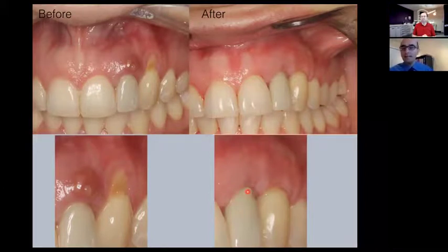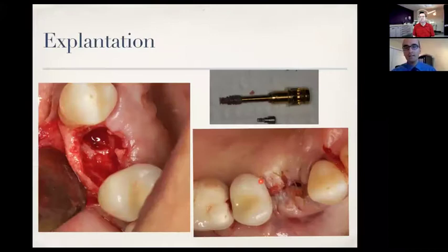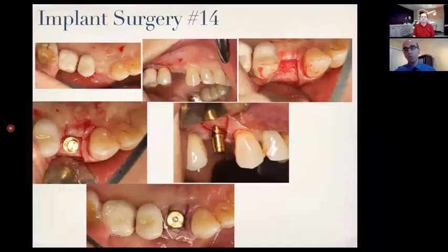But peri-implant diseases are a health concern because we are dealing with deep pockets, bacteria. And we know many studies have shown significant association between bacteria in the oral cavity with systemic diseases. I discussed this case before in the previous discussion we had in this platform. I don't want to actually spend more time. This implant, as a result of a poorly fitting healing abutment, we got distal bone loss. Unfortunately, this implant did not take, or the integration failed. We had to remove the implant and do the GBR and go later on with a new implant, a new procedure.